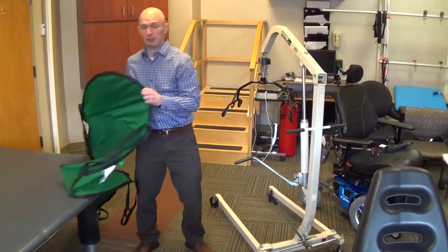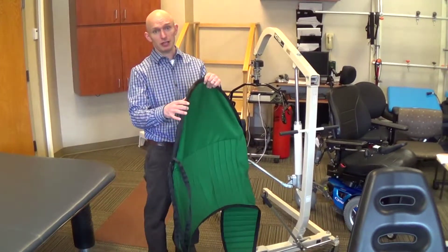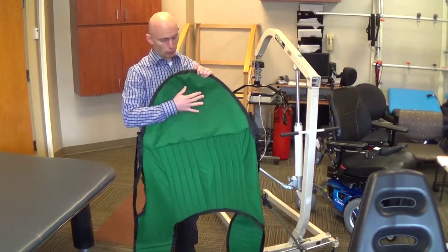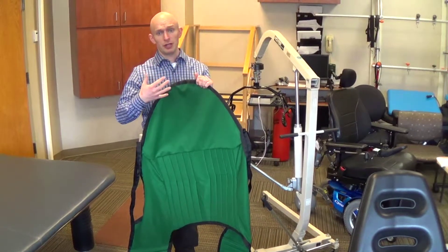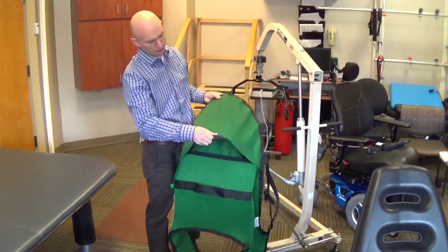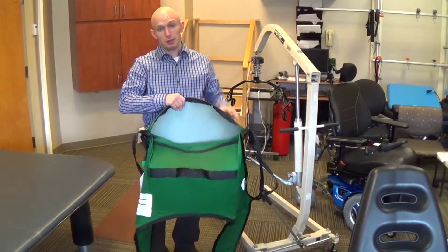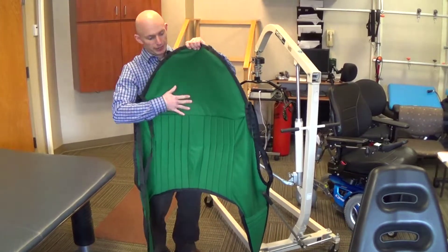There are different types of slings. Patients with ALS tend to prefer what's called a divided leg sling with head support. The head support is important due to disease progression — it gets harder to hold the head and neck up over time. Inside the sling, you'll see a rigid but flexible surface that supports the head and spine.